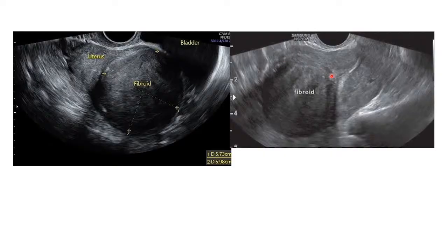So again, if you look here, you can see that's the uterus. Then this is the cervix. You can see the cervical canal there. Then you can see this is the body of the uterus there, and you've got another huge fibroid, the Venetian blinds. So these lines that you are seeing here, this is what we call the Venetian blinds. So this is a fibroid, the whole of that. It's a well outlined fibroid.